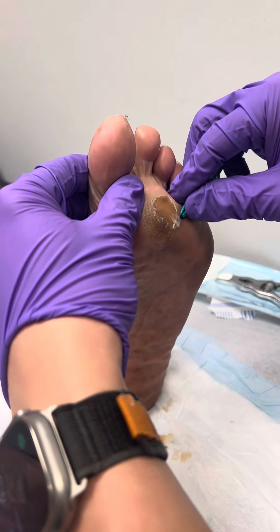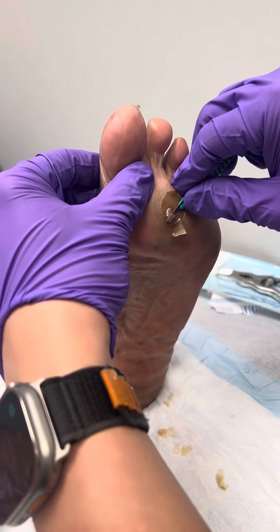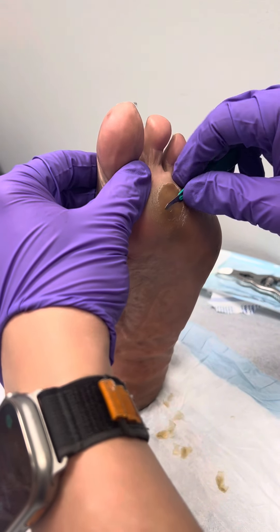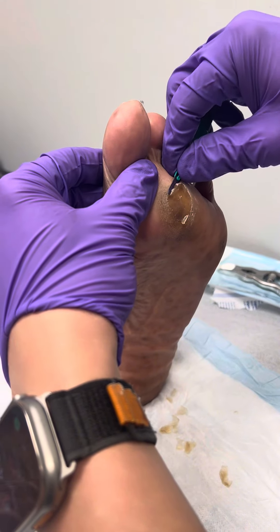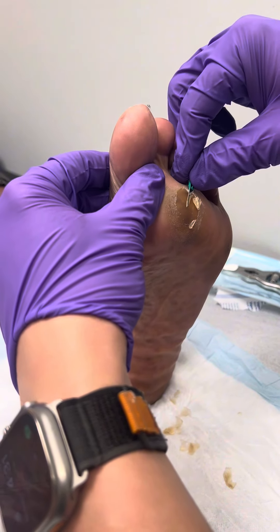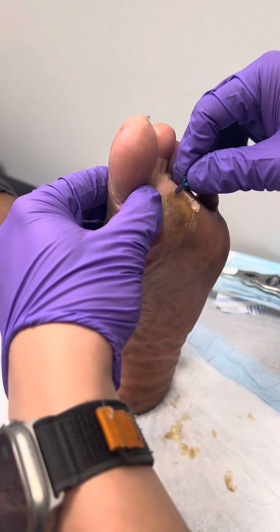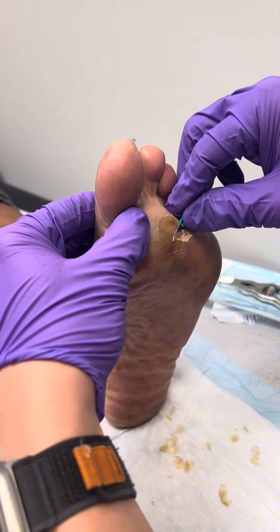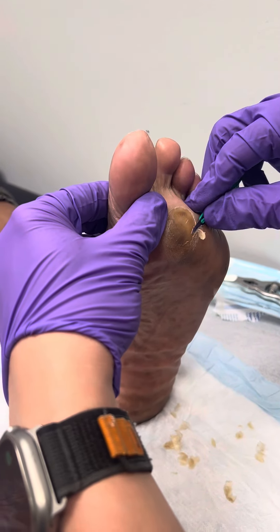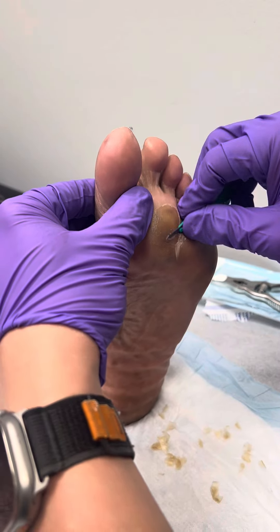A lot of you may ask how we know that we're not getting into the actual skin — that we're just in the layer of dead skin. A lot of that is just practice, a lot of that is just feel. We can kind of feel where the dead skin layer is, so we let the blade find its path. The dead skin is softer, so it allows us to glide through that layer pretty easily.